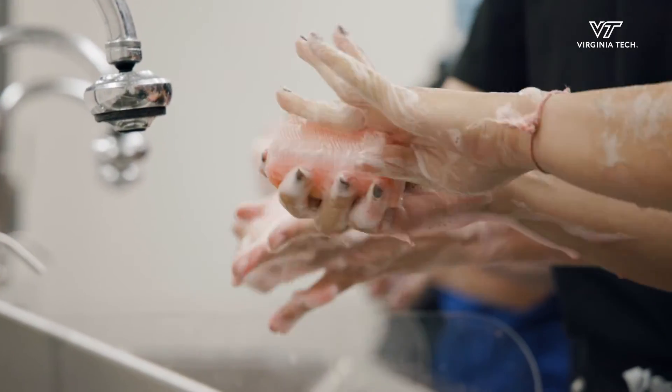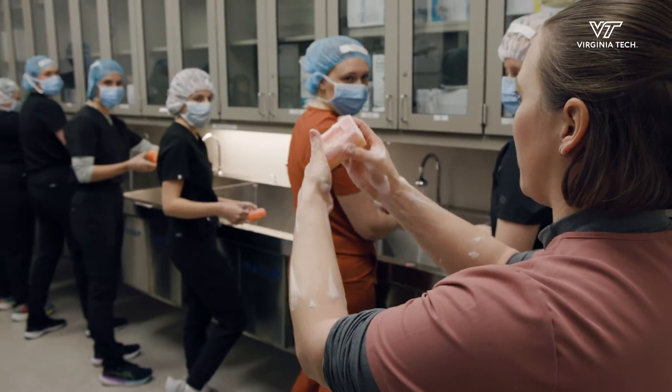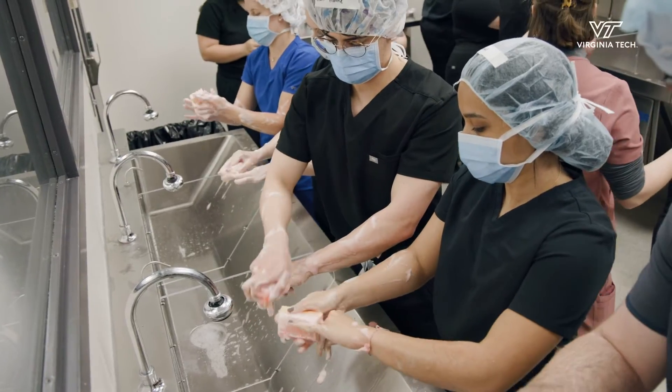You're going to take your stroke brush. You're going to go back to the top and you're going to start doing your 10 strokes over each surface. You're going to work all the way around.